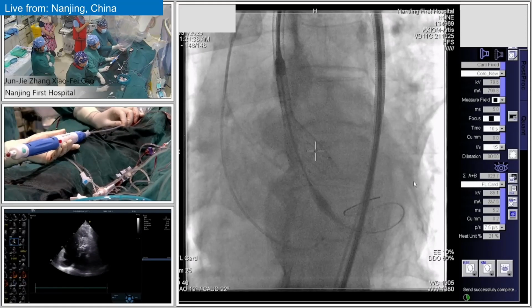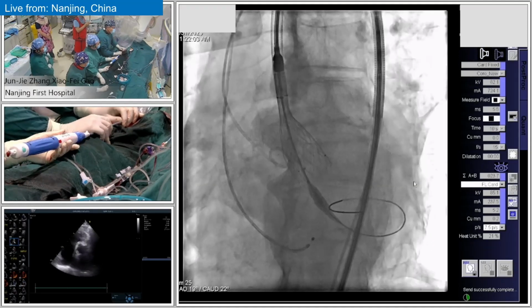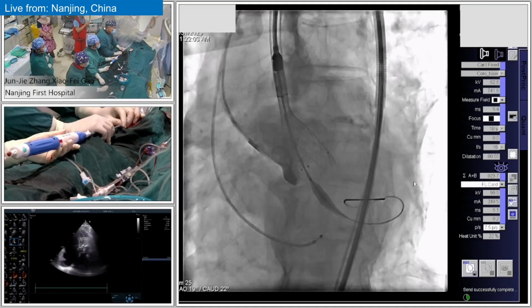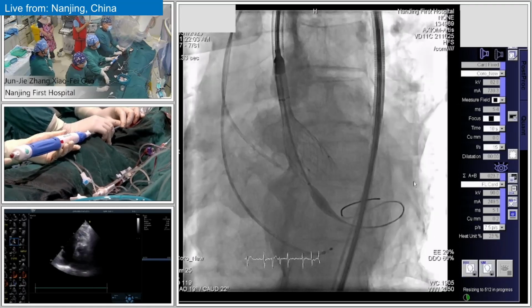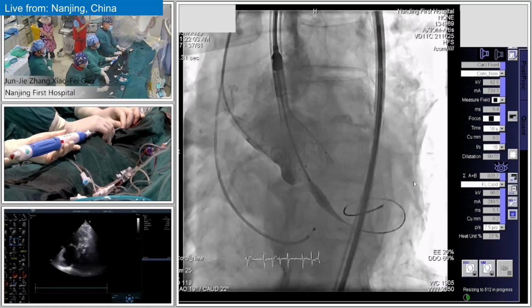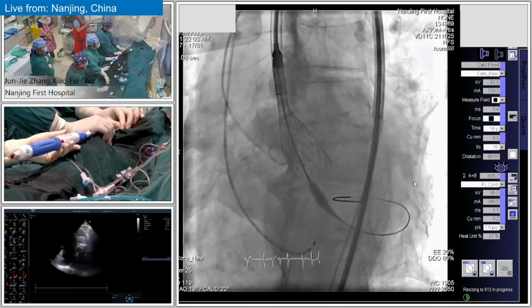And you see at this time the BP is good. I think a little high. What do you see? I think it's good. Good. This is the position we like. So at this time, I will try to release the valve.